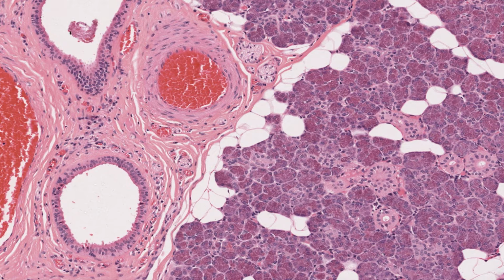The interlobular duct is an excretory type of duct whose function is simply to carry away the secretion. The duct will be surrounded by interlobular connective tissue and lined by an epithelium that can be simple columnar, pseudostratified, or stratified columnar, depending on its size.